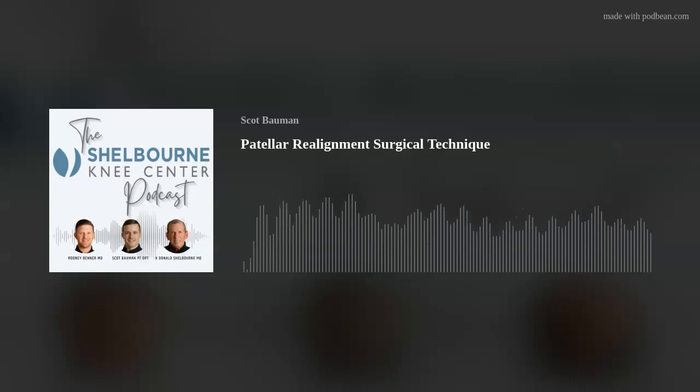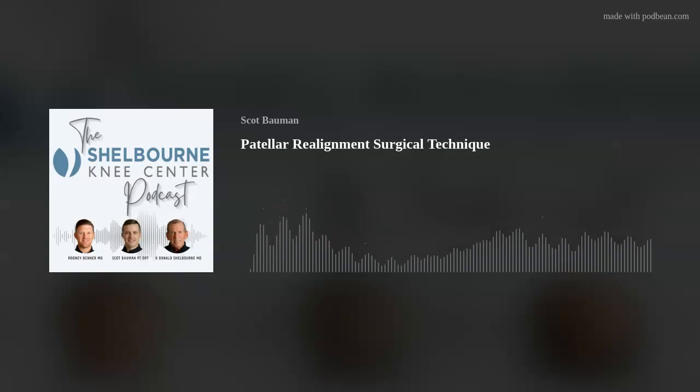We make an incision on the lateral side of the tibial tubercle. We outline a 1 centimeter thick and 6 centimeter long osteotomy, starting at the patella tendon attachment, where we make sure to get a finger and then a retractor behind the tendon in that bursa that's between the tibia and the attachment of the patella tendon. Then we use a broad flat osteotome to make a 1 centimeter thick and 6 centimeter long osteotomy. Once that's done, since we do the osteotomy from lateral to medial, it's at a 90-degree angle at the end. We have to go out and free it up from those medial soft tissues so we can pull it distally.